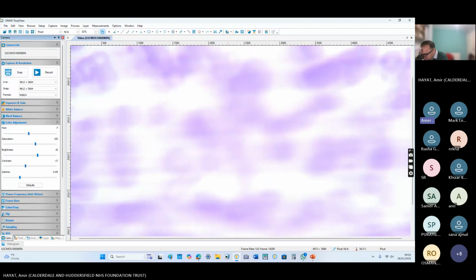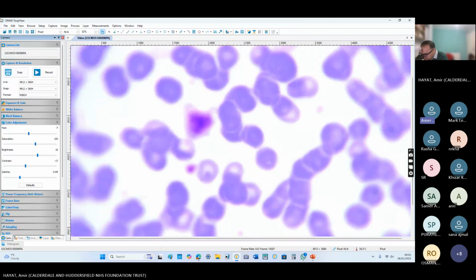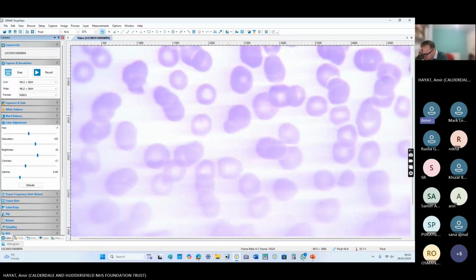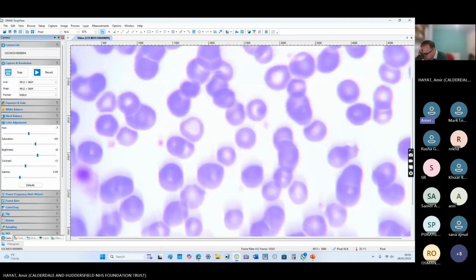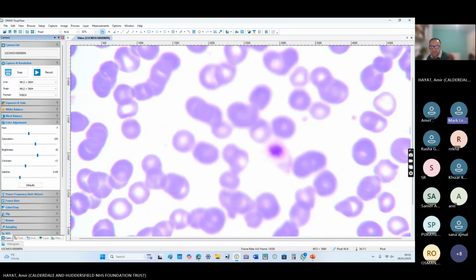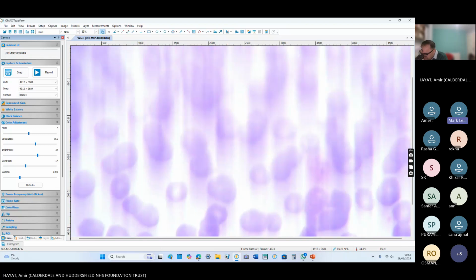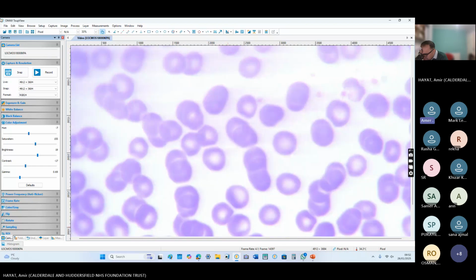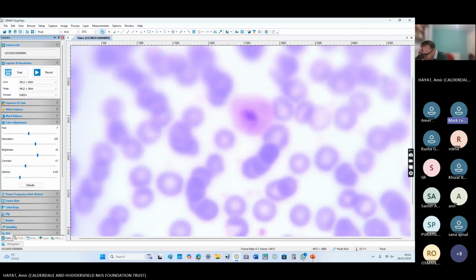Is Mark with us? I am indeed, yes. Do you have any fresh LGL slide with you? I have this one, but this one is old and the stain has. No, I can't say I haven't seen many LGLs. I always see the blood film of autoimmune disease patients and I hope to find LGLs in them.